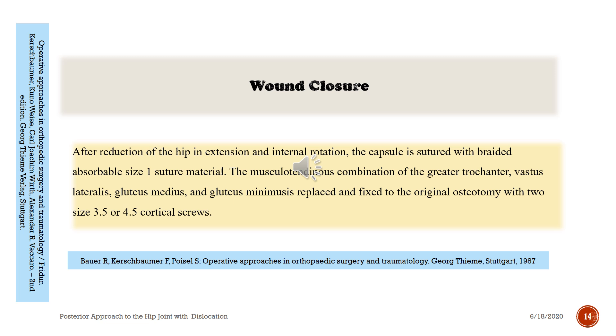After surgery or internal fixation, closure proceeds after reduction of the hip in extension and internal rotation. The capsule is secured with braided absorbable size-one suture material. The musculotendinous combination of the greater trochanter, vastus lateralis, gluteus medius, and gluteus minimus is replaced and fixed to the original osteotomy site with two 3.5 or 4.5 cortical screws.